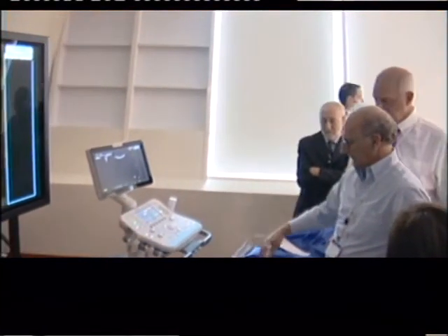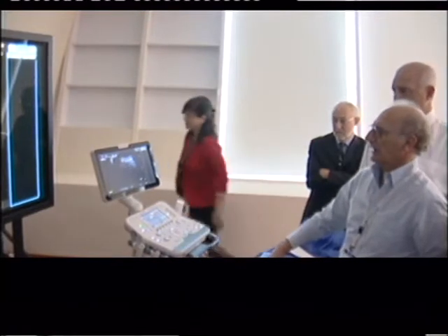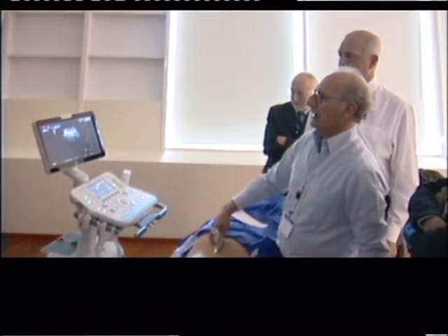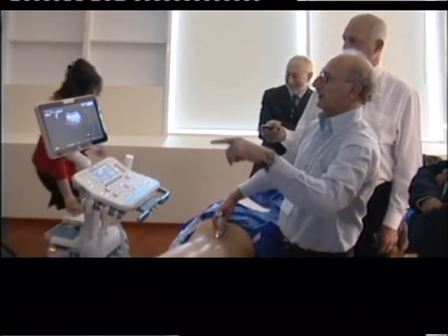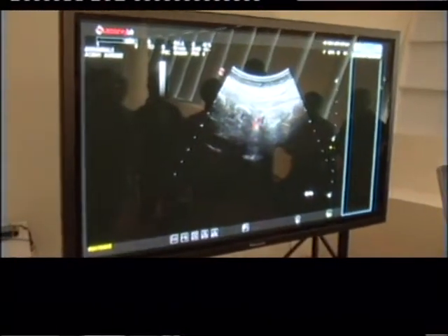I can see it's more simple, a longitudinal scansion, to understand, to study the angulation of the single vertebra. And this is interspinal. These are spinous processes. And then interspinous ligament. And then the spinal canal's down here.